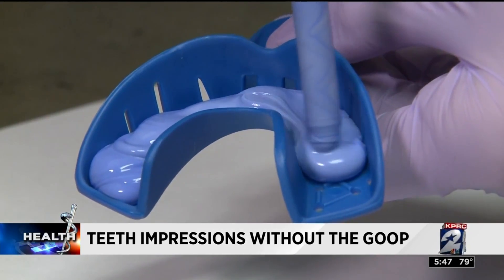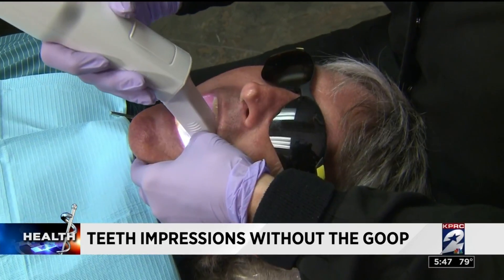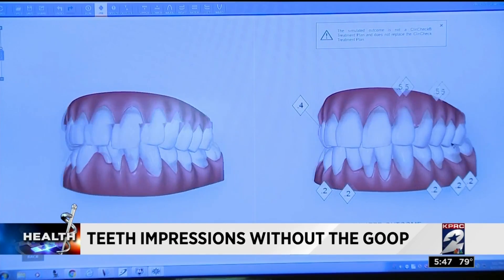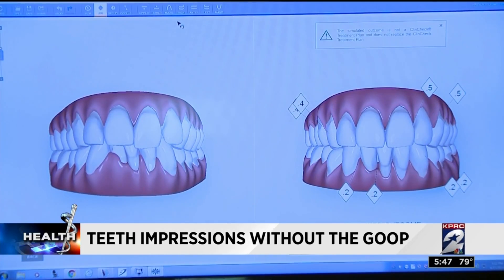Which is a big improvement over the goop's accuracy, which tends to expand or shrink at the lab. Terry's teeth were scanned when he was being fitted for Invisalign. The picture on the left is the before scan, and the picture on the right used the scanned impression to create a picture of what Terry's teeth will look like after he's done with Invisalign.